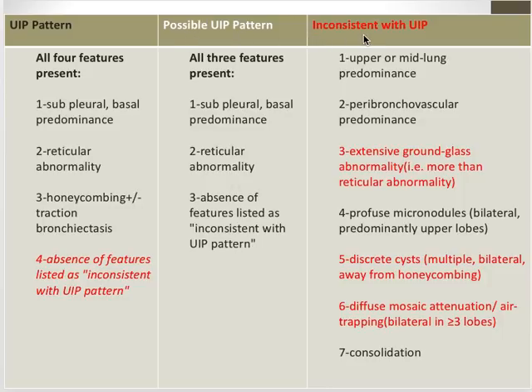Then what is inconsistent with UIP? If these 7 features are present in the CT chest, it is inconsistent with UIP. What are these?